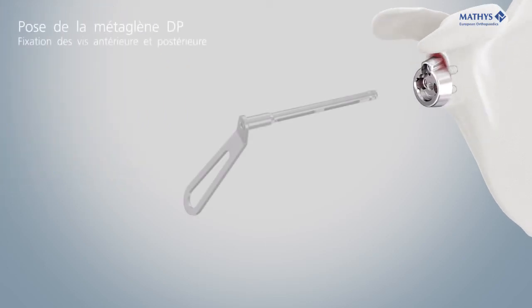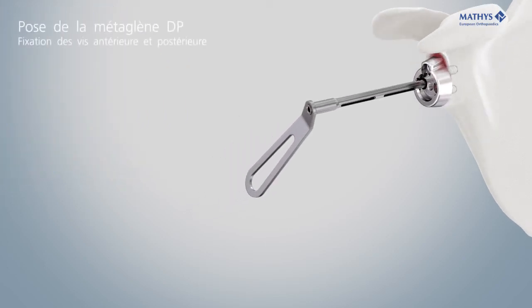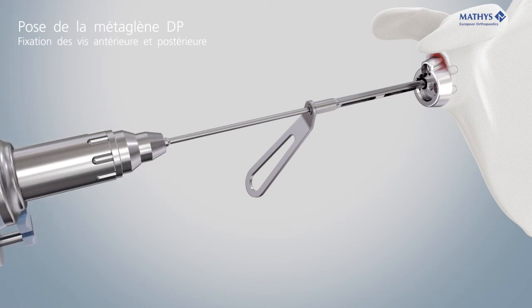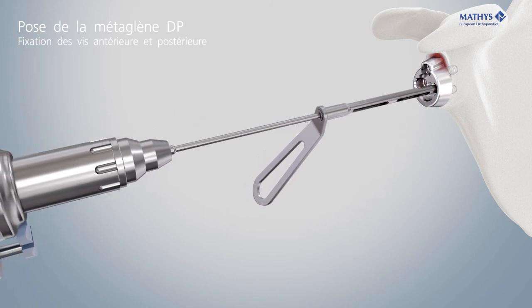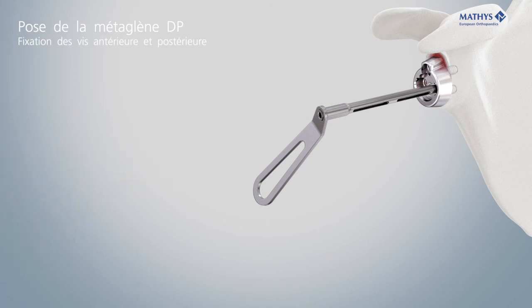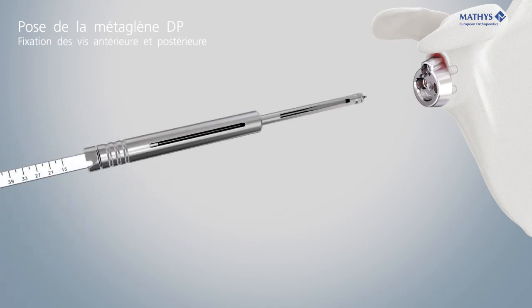Hold the drill guide into the screw holes in the metaglene and drill the holes for the screws in parallel or slightly convergent orientation relative to the pegs of the metaglene. The screws can be aligned with an angular freedom of ±8 degrees.